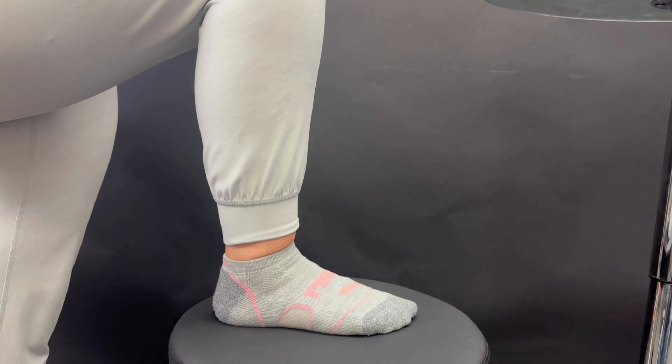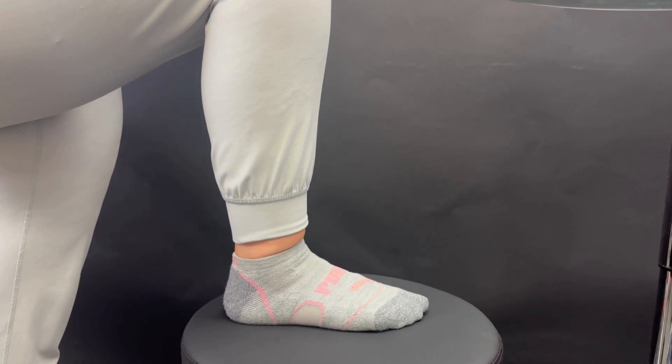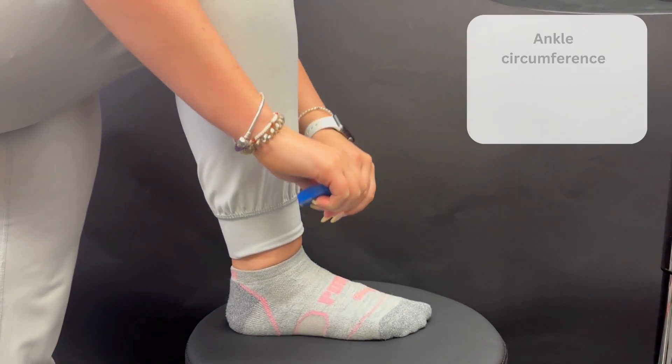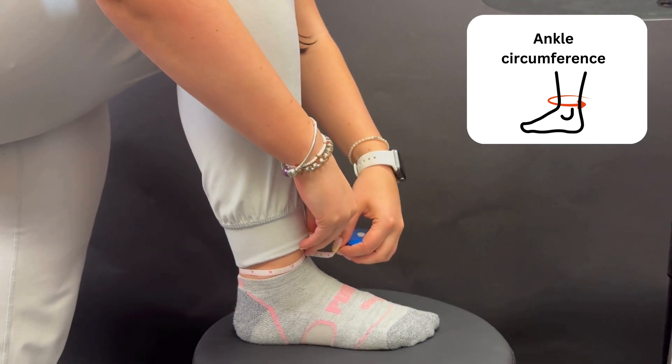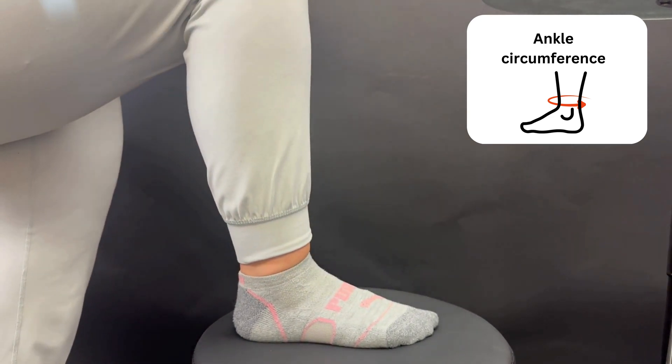Now we're going to go over the measurements for the fibula tape. You are going to take the measurement of the distal tibia, right above the malleoli. Take your measurement around the ankle and then select your size.